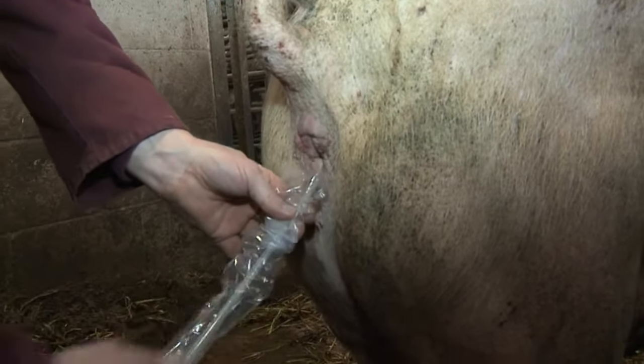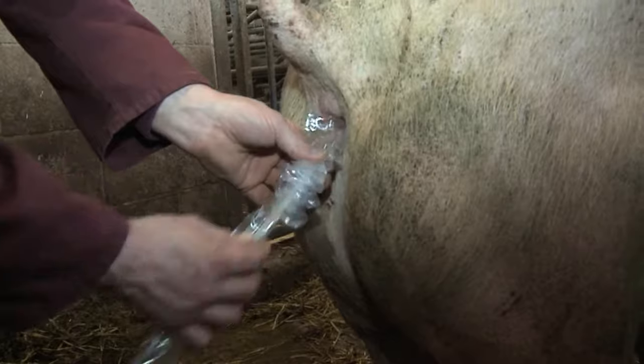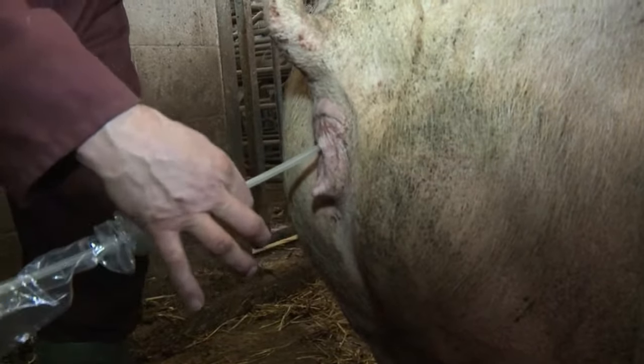With a sponge plug catheter, gently push it in at a slightly inclined angle until you feel resistance. Check the catheter is locked in the cervix by gently pulling the catheter back and feeling it snag.